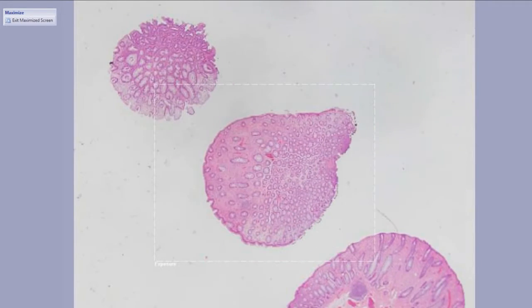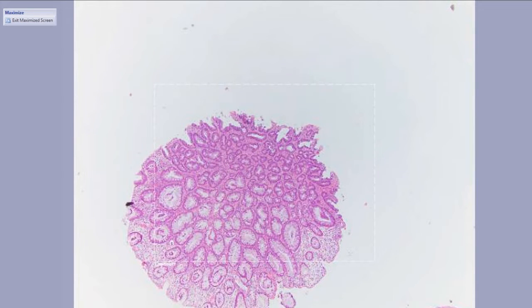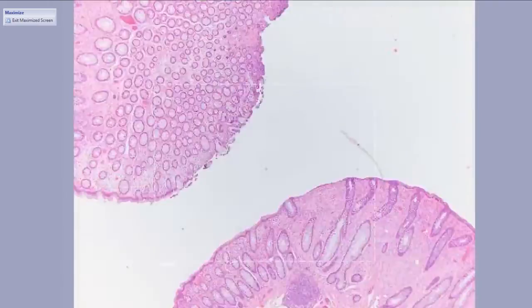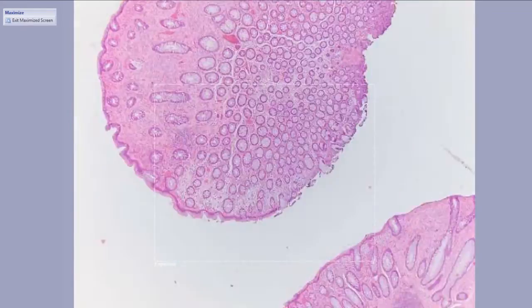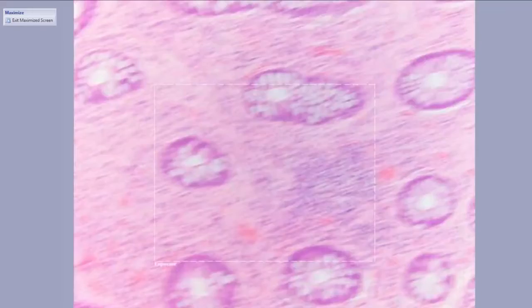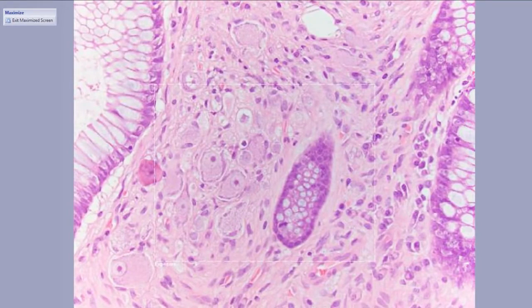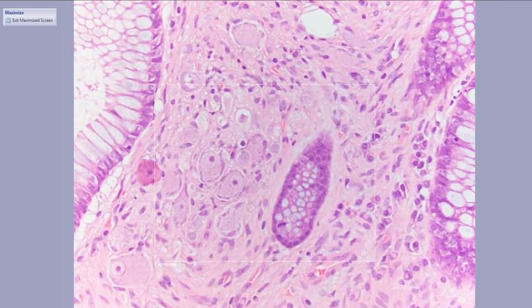Next up, another colon polyp, another one that gets people worked up. I'm actually going to point out that this specimen had 2 colon polyps, and this up here is a TA, which is actually more important for this patient than the mesenchymal thing I'm going to focus on. We have this spindly thing expanding the lamina propria, and if we go in on higher power, spindly. Is it one of those things I just showed you? Oh, let's look over here. Oh, this is easy. Look at all these ganglion cells everywhere. This is very easy to diagnose as a ganglioneuroma. S100 positivity will confirm the diagnosis.